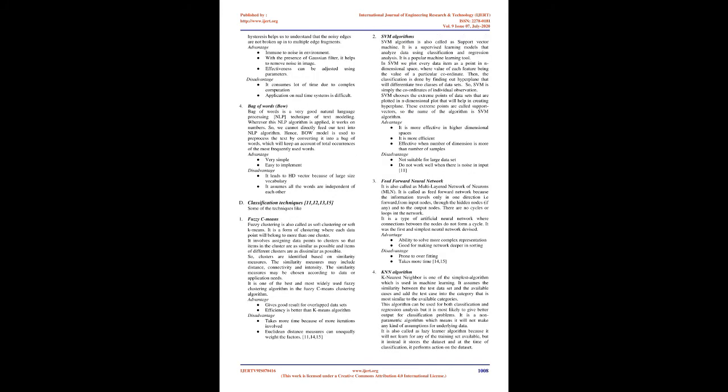By estimating a threshold value for the different regions from the intensity histogram, local thresholding can be determined. So, the threshold values of local thresholding are identified by using local statistical properties like mean intensity value, by the prior knowledge and by calculating partial volumes for each region to determine the threshold for the segmentation of each component. And also, the Gaussian distribution was applied to spot the thresholds in normal MRI images.